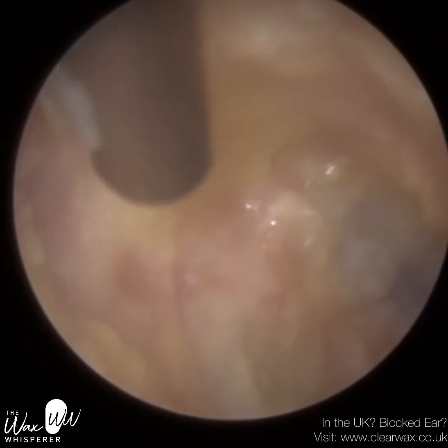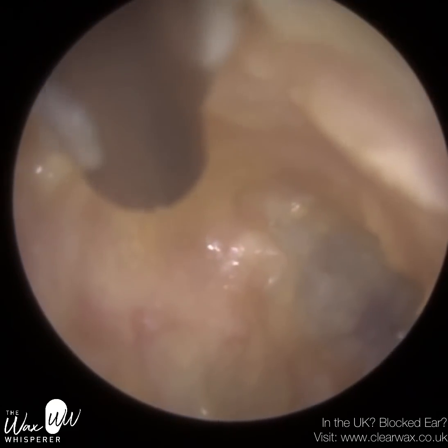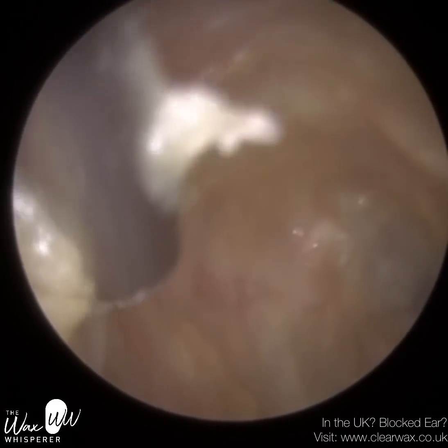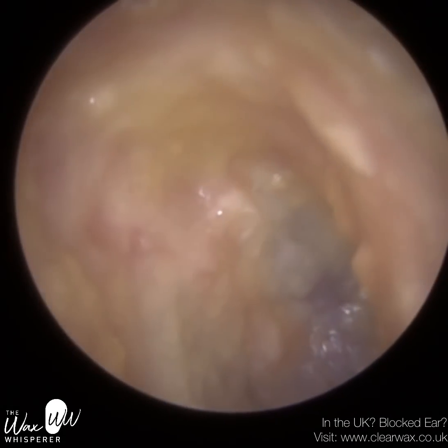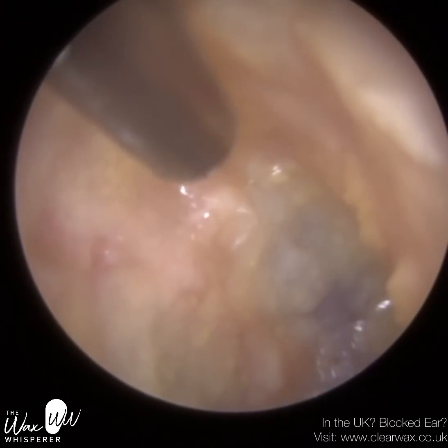And fortunately, the patient is really still for me, because it's not always possible to perform these types of procedures on some patients, and it just depends how steady they are themselves. Because if the patient does move and you're that close to the eardrum, there's no real getaway. The suction probe is going to make contact with the eardrum if they move suddenly.